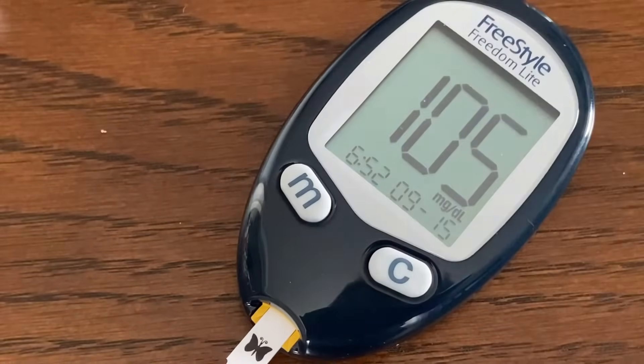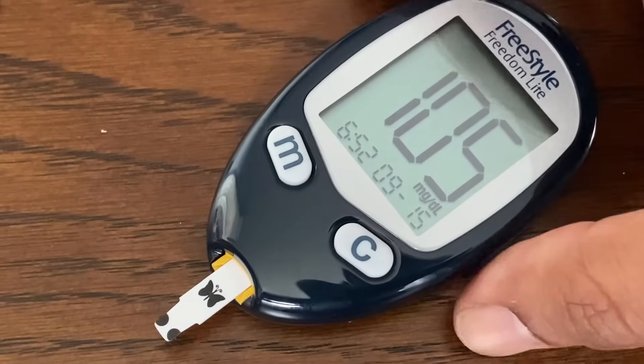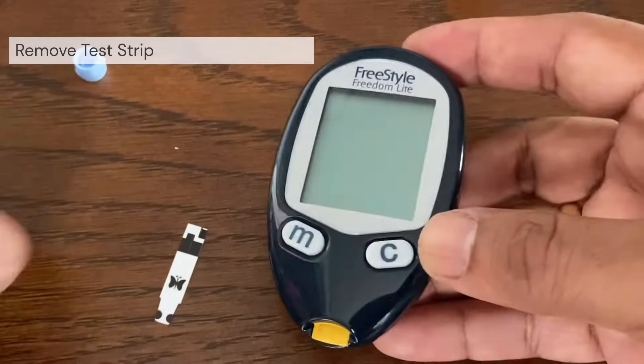The result appears on the display when the test is complete. The time that the meter takes to display a result depends on your blood glucose level. To turn the meter off, just remove the test strip.